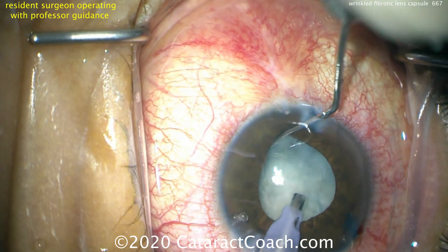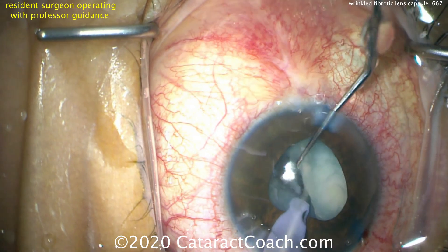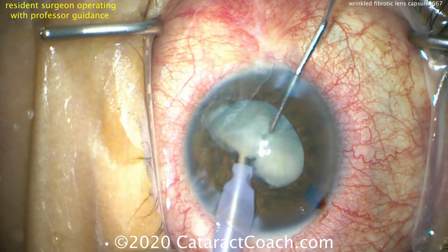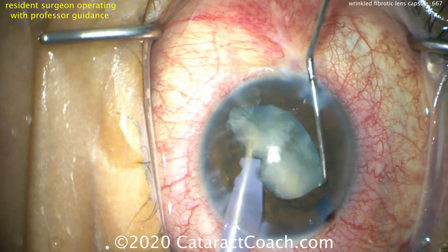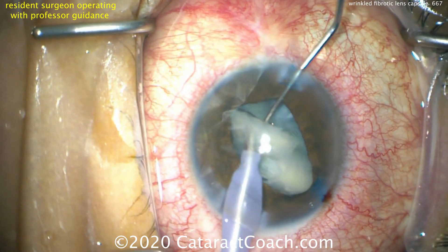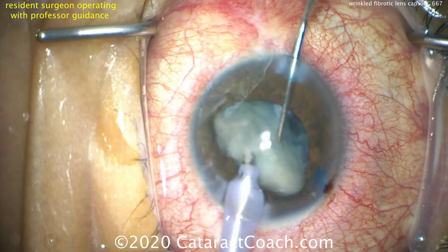Take our time. We're going to bring that nucleus up and try to get it out of the capsular bag. It's not very dense — the central part has a little density to it, but mostly this is cortical whiteout. We just chopped it into two halves and we can break it up more. This will emulsify very quickly. Certainly in this case, the difficult part of the case is not nucleus removal.